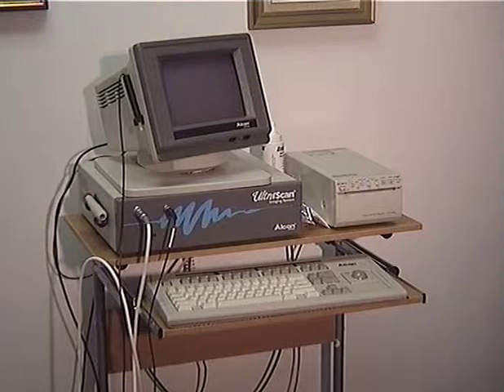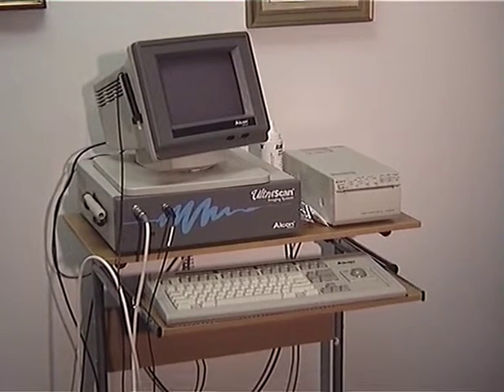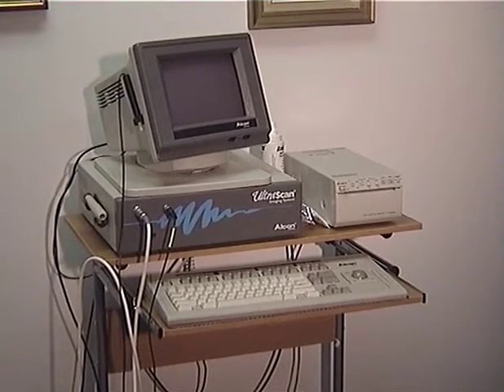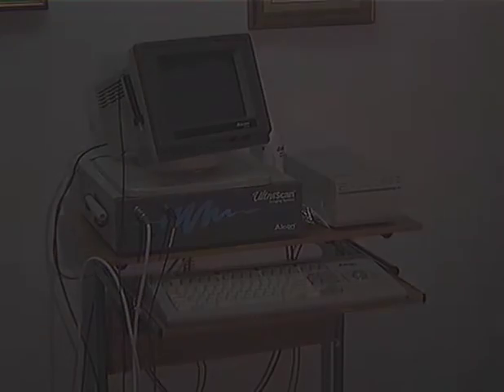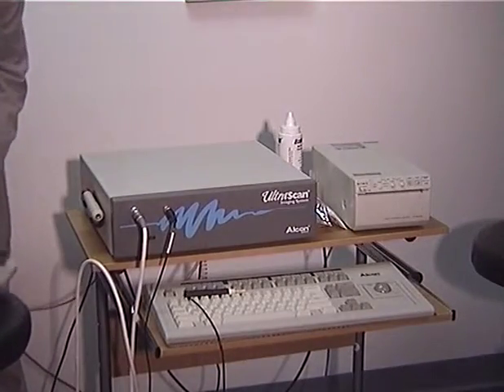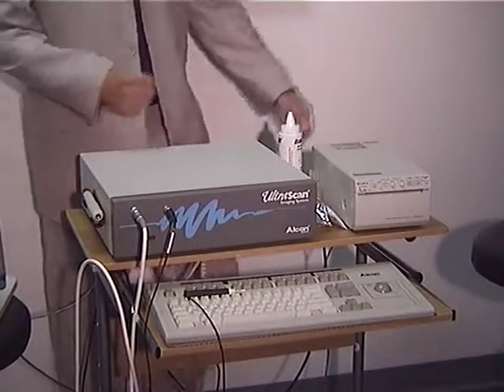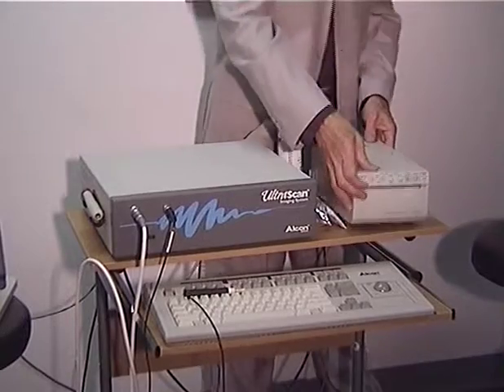The only way to avoid this unhappy outcome was to organise a B-scanner. So I rang my good friend George Briscoe at Alcon, and he made available this equipment. But the problem was the logistics of transportation — there was no way the monitor was going to survive the journey, let alone the printer, and they had to be dispensed with.